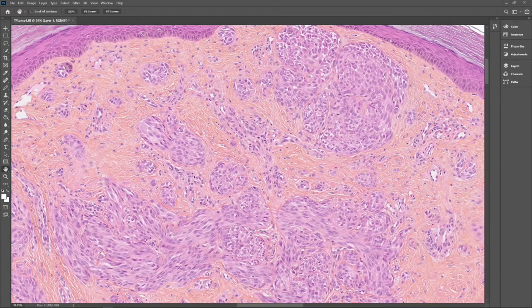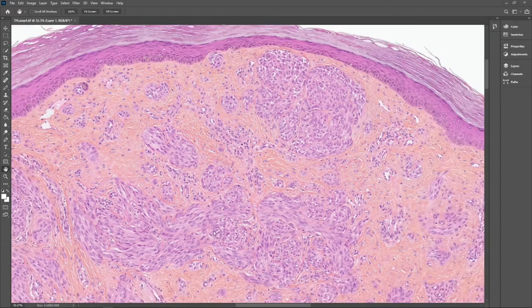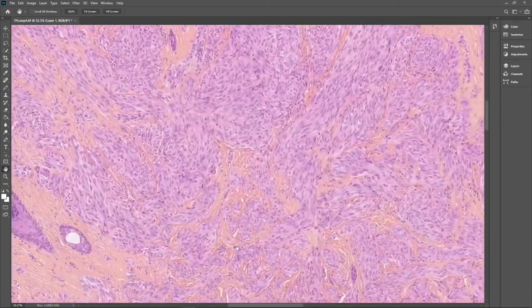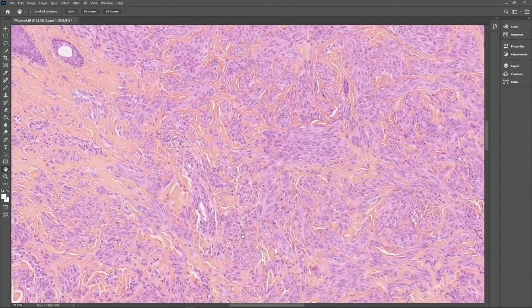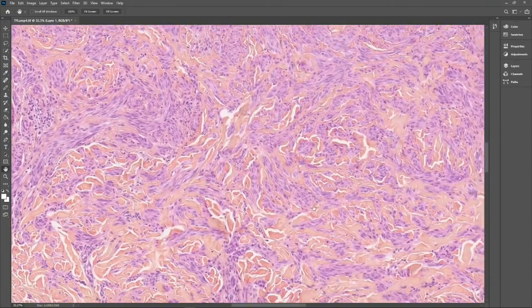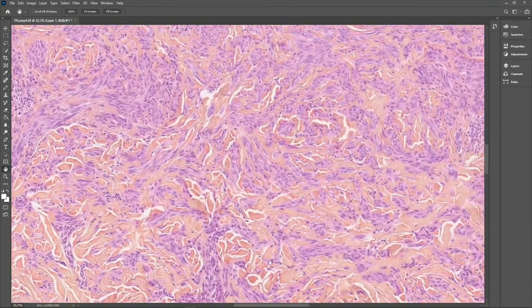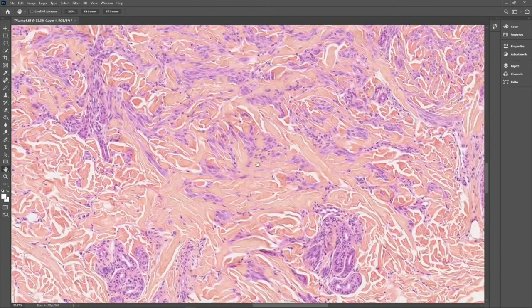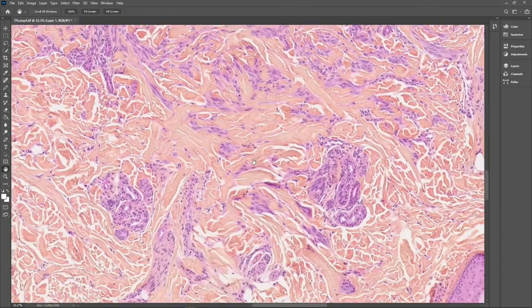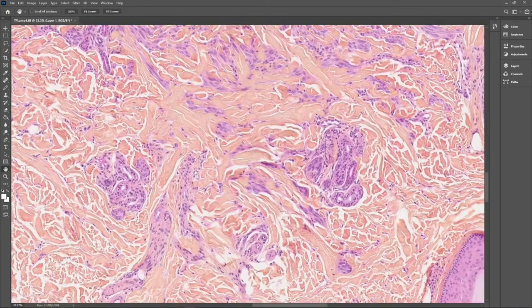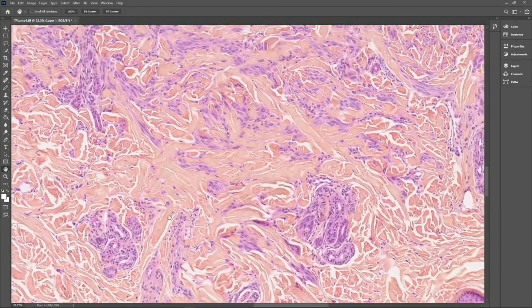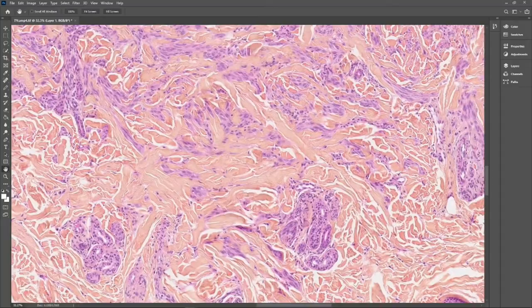If we go downwards, we see that the size of the nests is diminishing and we have exactly the same cytology. The fascicles get smaller as we get deeper into the dermis.